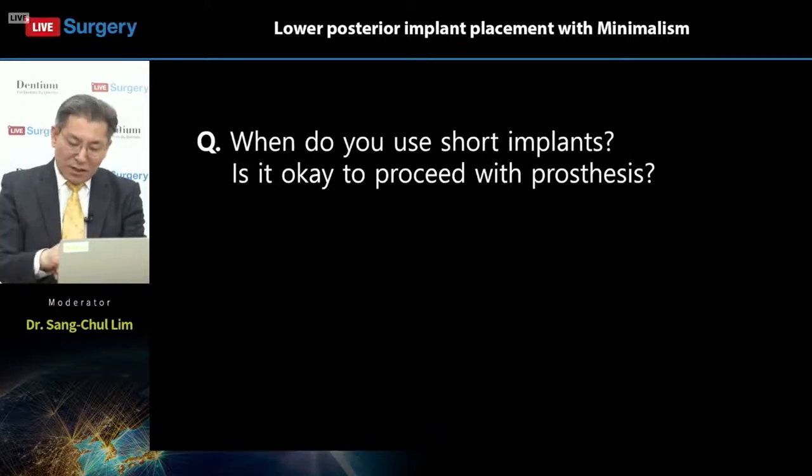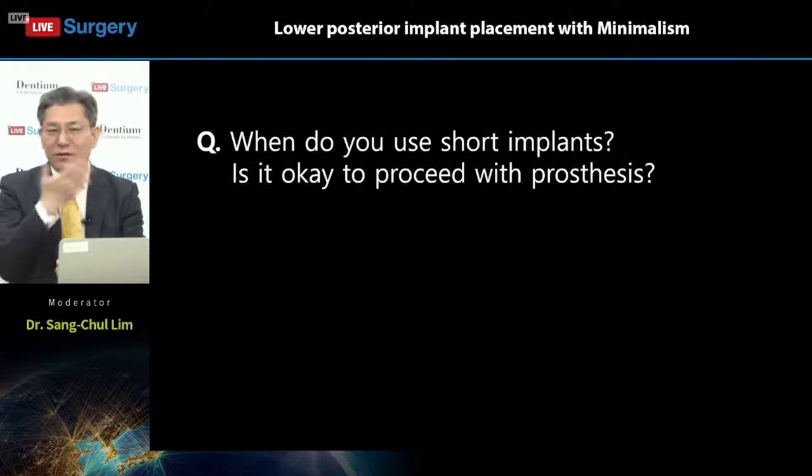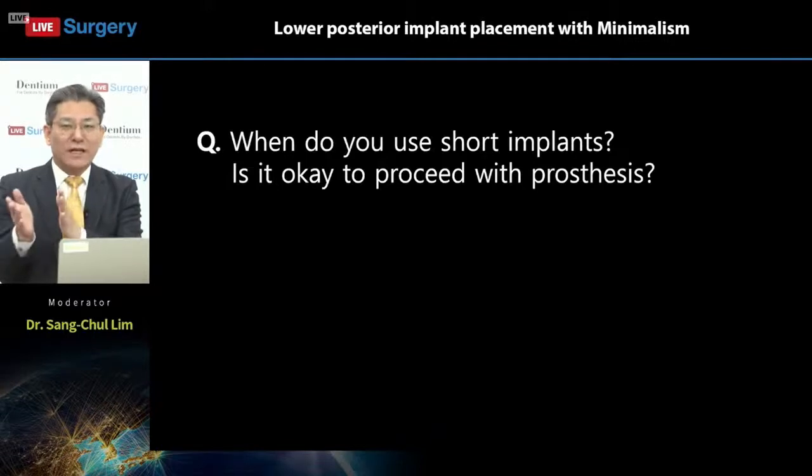So I recommend that if you use a short implant, anywhere in your patient, a solitary short implant carries some risk, especially in the posterior maxilla. So I strongly recommend that more than 2 implant fixtures should be inserted when you use short implants.